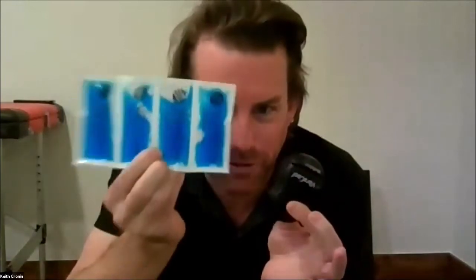But all of you out there are going to say, wait a minute, when you do cold, it cuts blood flow. And you just talked about all this stuff to increase blood flow. I'm like, well, you are right. You did read all of your literature, but I also hate to break it to you. When you put a high frequency vibration at the low amplitude over a blood vessel, it also opens up the blood vessel, so it counteracts the effects of the vasoconstriction, but you still get the pain control of the cold, as well as the thing that stimulates that Pacinian corpuscle, which is now you're going to have in your daily verbiage talking about Pacinian corpuscles. Okay, just don't bring it up too much around the family. They're going to think you're a bit of a weirdo.